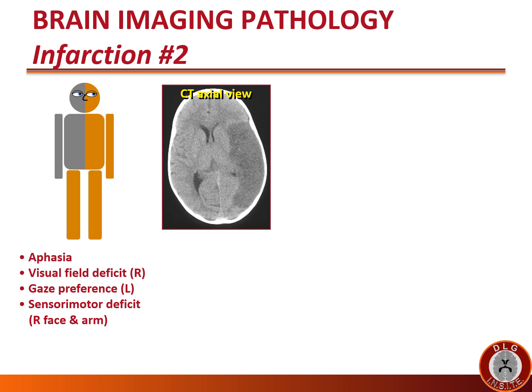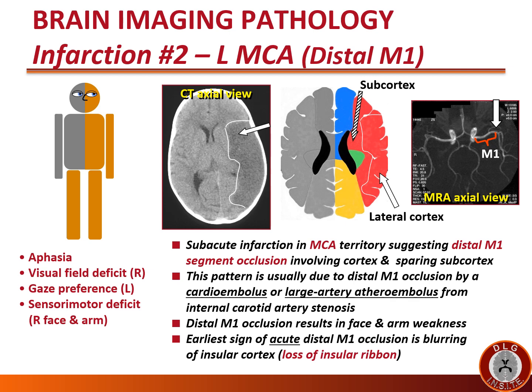This patient presents with aphasia, right visual field deficit, left gaze preference, and sensory-motor deficit involving the right face and arm. The CT scan shows a subacute infarction in the middle cerebral artery (MCA) territory, suggesting a distal M1 segment occlusion because it involves the cortex and spares the subcortex. This pattern is usually due to distal M1 occlusion by a cardioembolus or large artery atheroembolus from internal carotid artery stenosis. Distal M1 occlusion results in face and arm weakness and spares the leg. The earliest sign of acute distal M1 occlusion is blurring of the insular cortex — often called loss of insular ribbon.